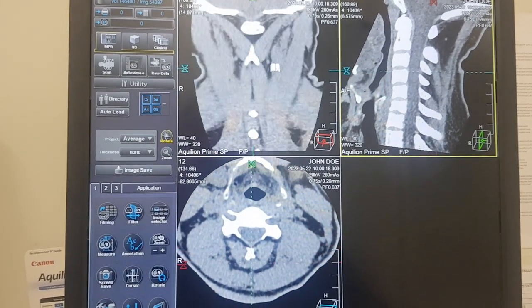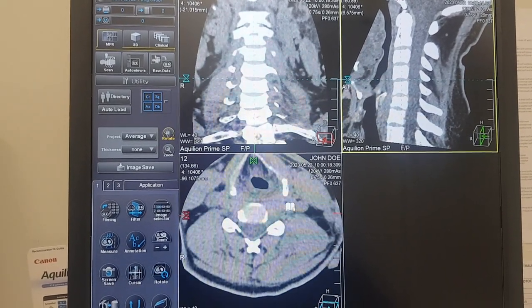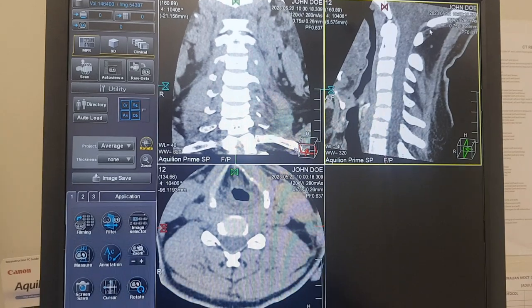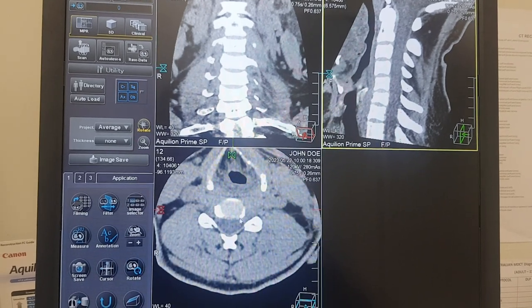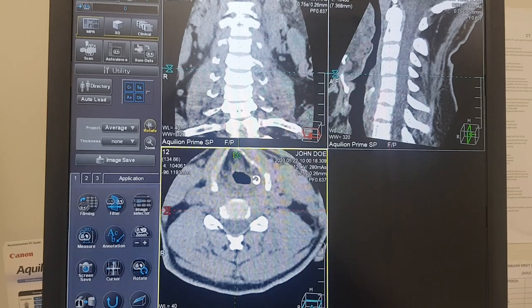Make sure that it all marries up — grab that little axial. C4/5 is basically a happy medium from the top half to the bottom half of your c-spine, and with the general curvature you should be able to get through your disc spaces better.